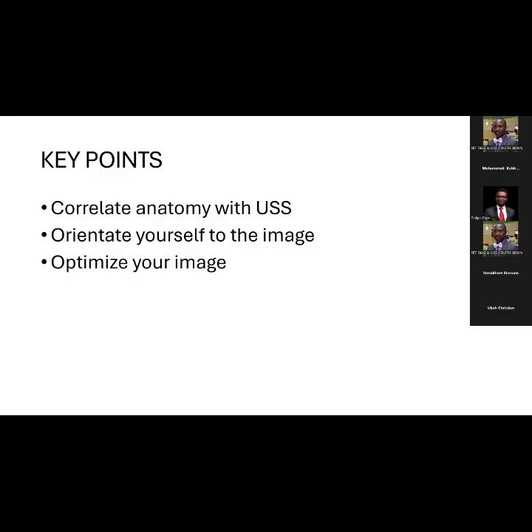Okay. Yes, because that woman, even if she's postmenopausal, if you were to do IVF for her, you will treat the endometrium with estrogen, and it will be trilaminar. The trilaminar is just a suggestion that the endometrium has become estrogenized, from the basal layer, which should be thin.